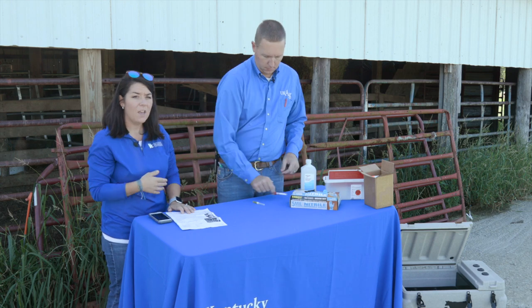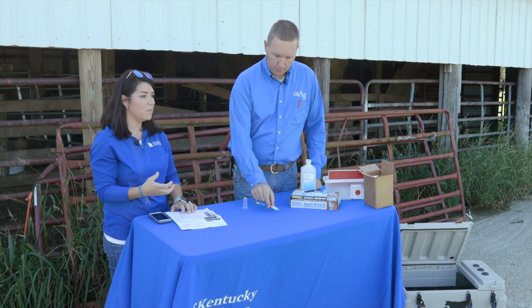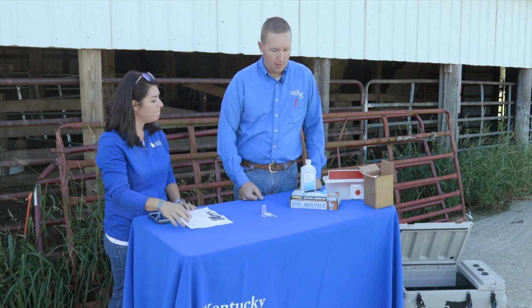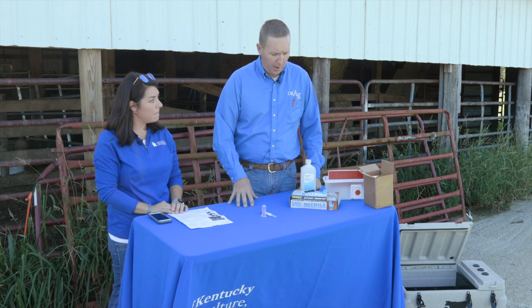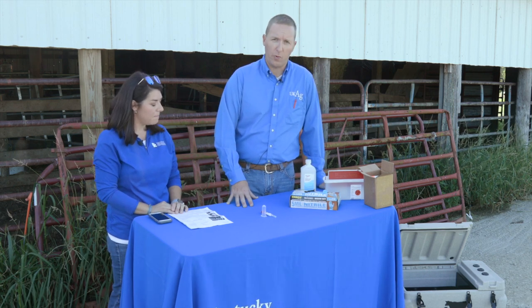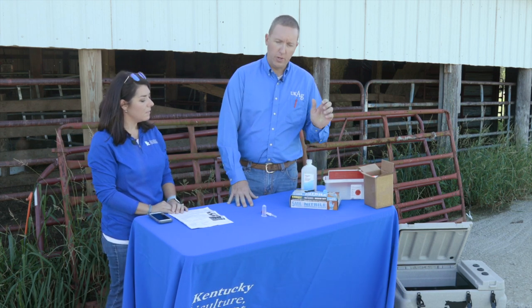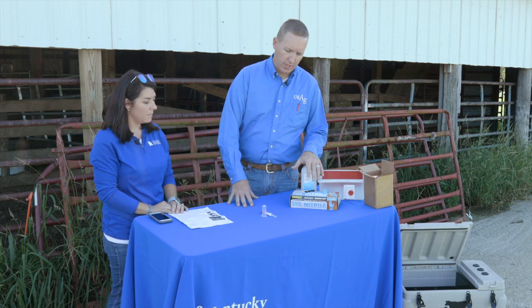We have a sharps container here and we want to make sure to demonstrate that today. If you don't have one, you can use a plastic dish detergent container that can be disposed of without nicking someone taking it to the garbage. We'll also wear a different pair of gloves with every cow so we don't contaminate our sample, and we'll use a paper towel with isopropyl alcohol or an alcohol swab to clean the collection site.